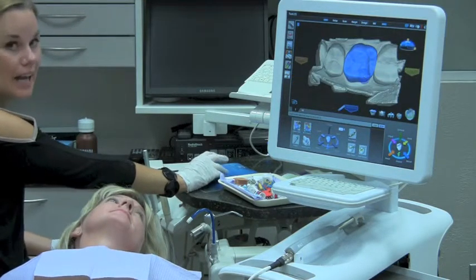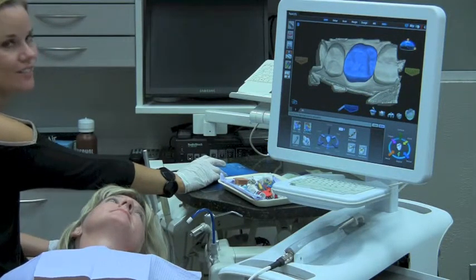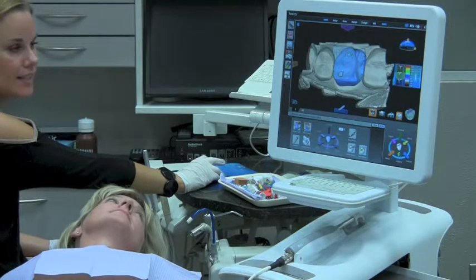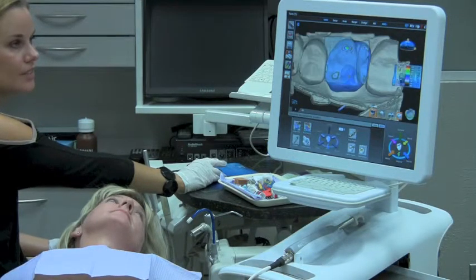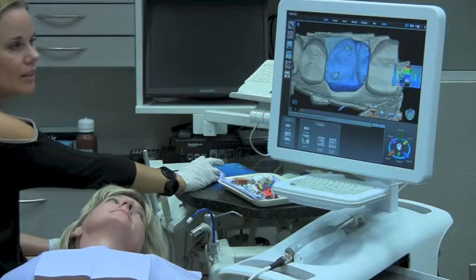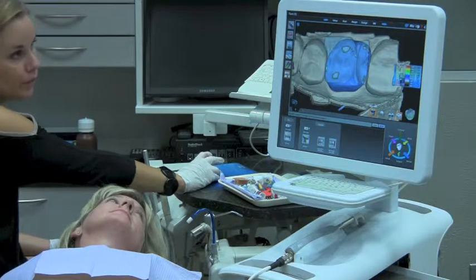When I'm happy with the design aspect, then what I want to do is check function — how is my tooth going to function? I can make it look good, but if it doesn't function well, we have a problem. So now I'm going to check my bite. By placing my opposing onto the model and turning on my view contacts, I can see color-coded contact strength in positives and negatives, and I can very easily see I have a few high spots. With one click of the contact refinement icon, I have the ability to circle the high spots and adjust them one at a time, or I could click refine and adjust them all. I prefer to circle.